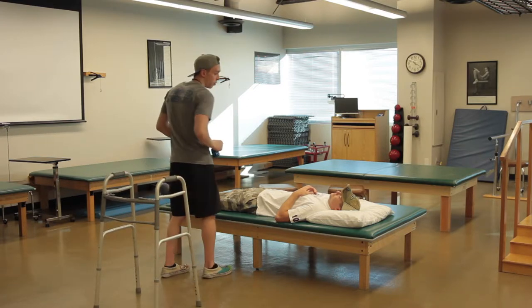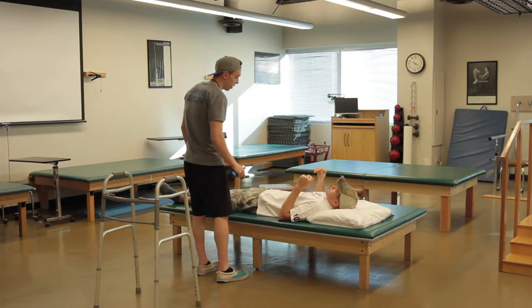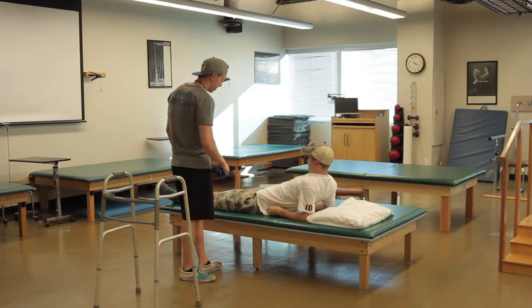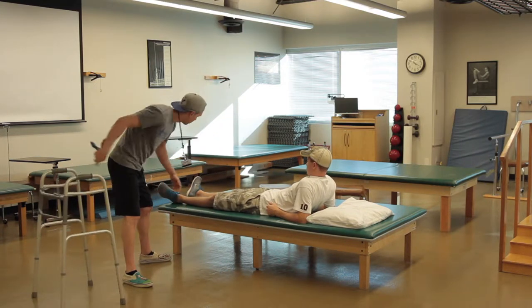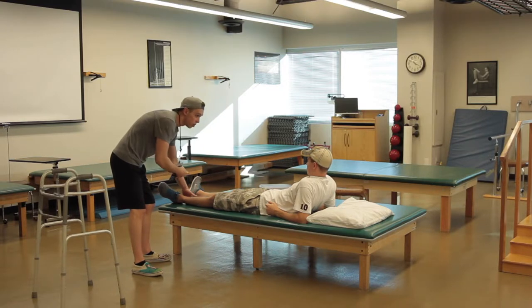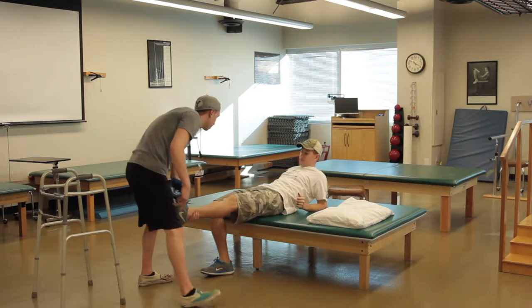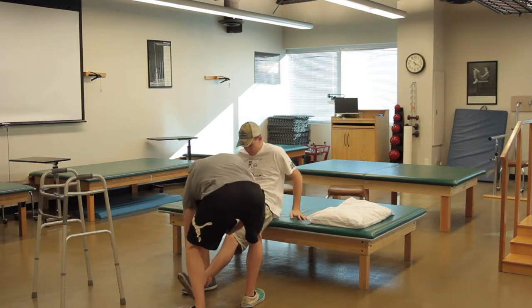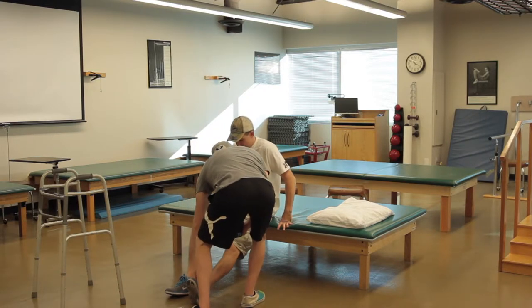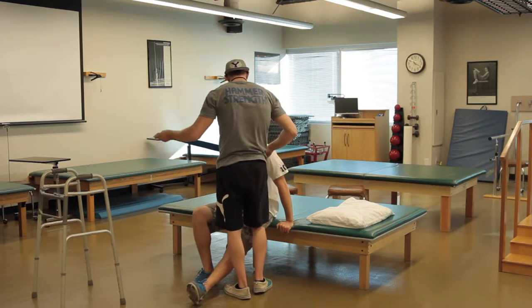So what I'm gonna have you do is just push up onto your elbows. So you're sitting up a little bit, but not too much. So we don't wanna, yeah, perfect. We don't wanna get that 90 degree angle. Okay, now I'm gonna support this leg, keep it straight, and then I'll have you rotate and use that right leg, of course. Okay, and I'll have you scoot forward to the edge of the bed, perfect. And that foot on the floor. Okay, perfect. We're gonna get this gait belt on you.